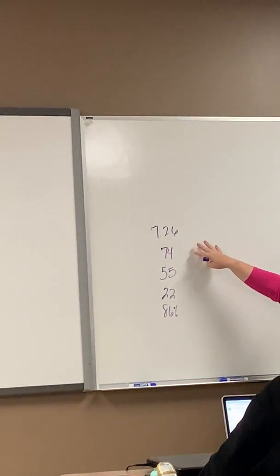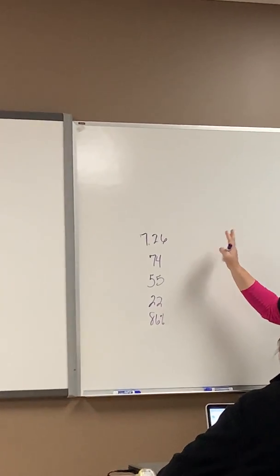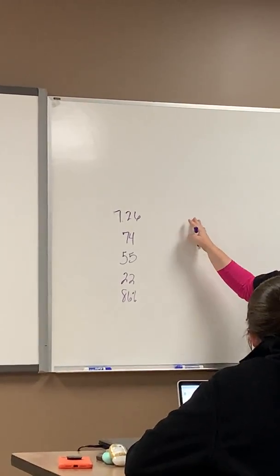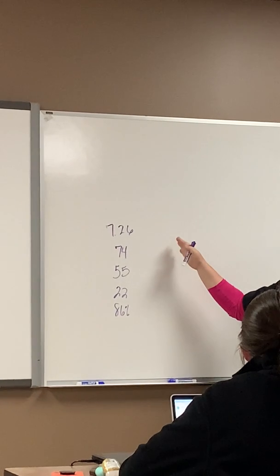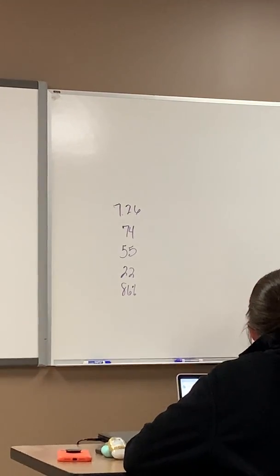So just basic, if your CO2 is high and your patient is hypoventilating, it's volume first and then rate. If your tidal volume is out of range, like you've already raised the tidal volume, then you would go to rate. But otherwise, it's always volume first. If you still have room to move your volume, then you go to rate.